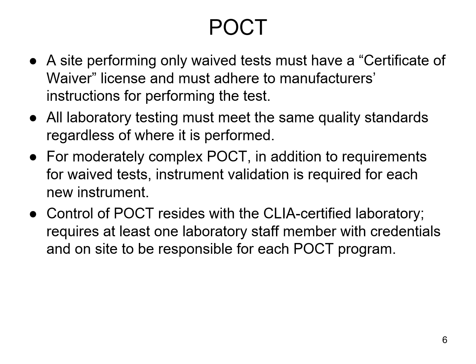Now, an example of a moderate complexity point of care test would be an iStat analyzer. So these are handheld analyzers that are issued by Abbott Laboratories. And these analyzers will do a variety of tests, just depending on the cartridge that comes with that analyzer or the cartridges that you order. So you could do a basic metabolic panel with some chemistry tests, hemoglobin, hematocrit.